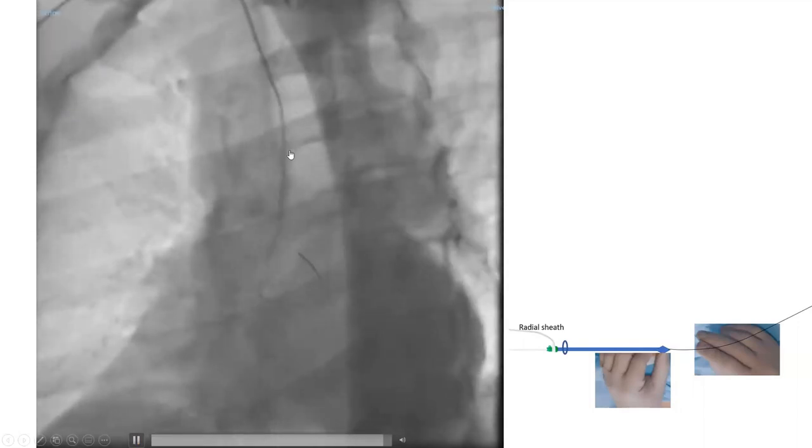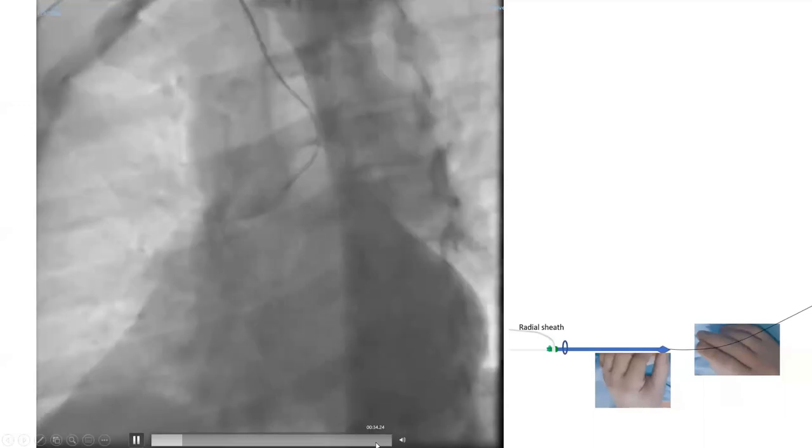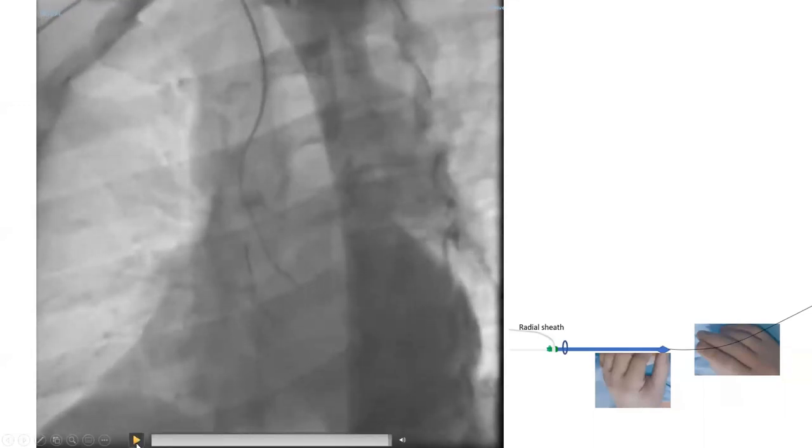Finally it was timed properly — the torque and the push was timed well to the elongation and we were able to get it onto the aortic valve. Is there another strategy if we fail to do that and the catheter and wire keep flying out? We don't often use it, but it's particularly applicable in extreme cases — such as extreme angulation between the innominate, or in the case of aberrant right subclavian, what we call arteria lusoria.